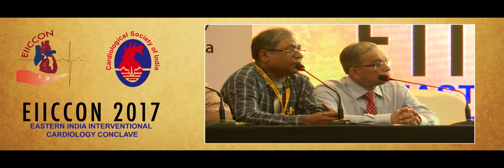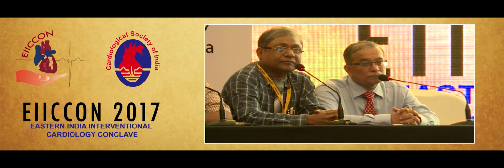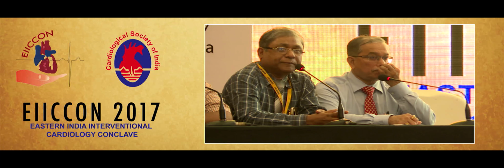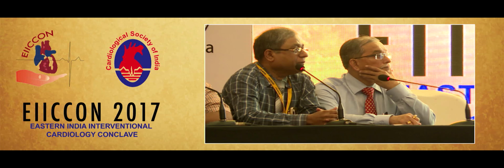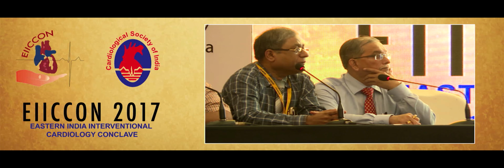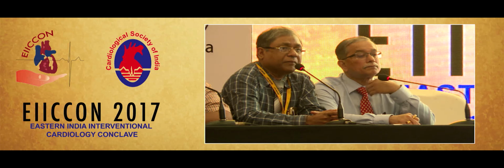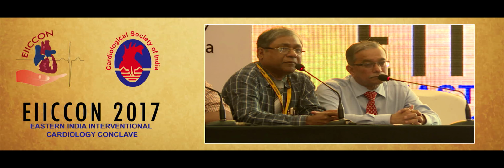Any comment from the audience? The point is, do you routinely keep a temporary pacemaker for rota in your center? No, actually for the right coronary we routinely put the temporary. But on the left side, if the patient is not complicated and has good hemodynamics, usually we don't put it routinely for the left side.